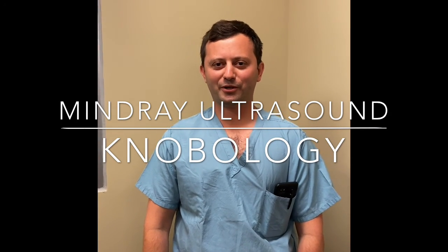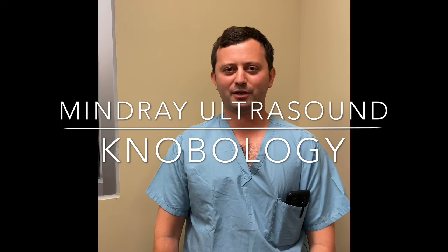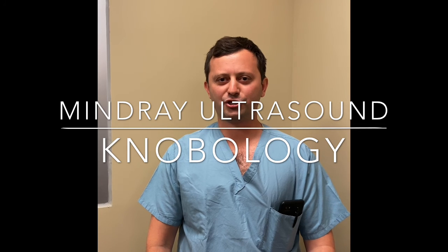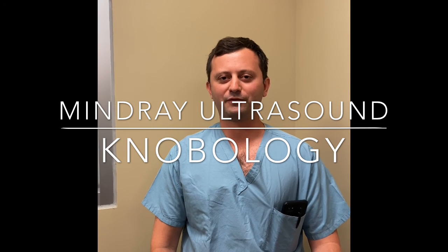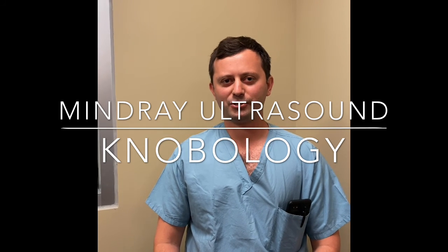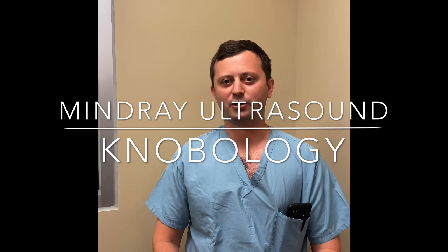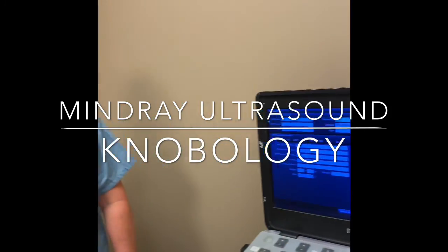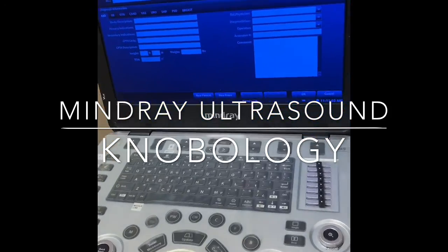Today we're going to be doing a quick introduction to using the ultrasound machine to initiate a patient exam and going over some brief knobology. We've had questions over the past several months on how to do this and issues with saving images properly to QPath, so hopefully this will be helpful. So now let's direct our attention over to the ultrasound machine.